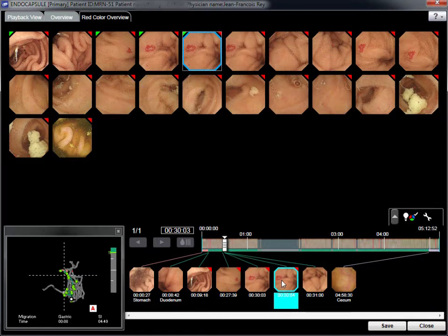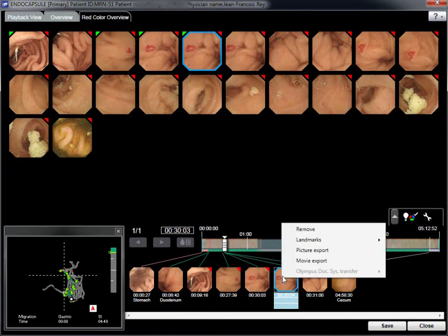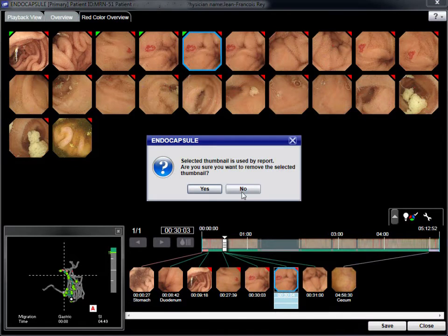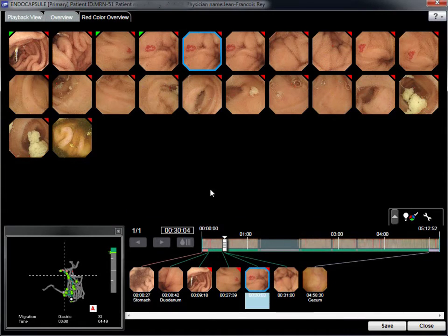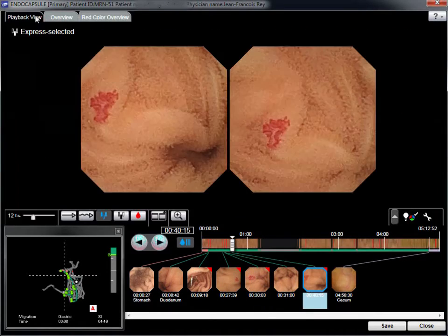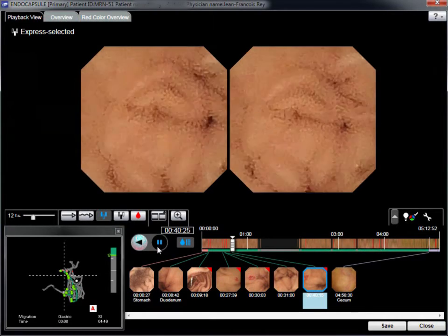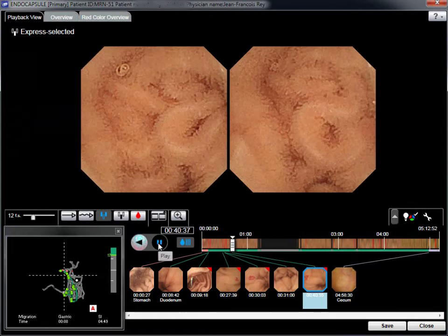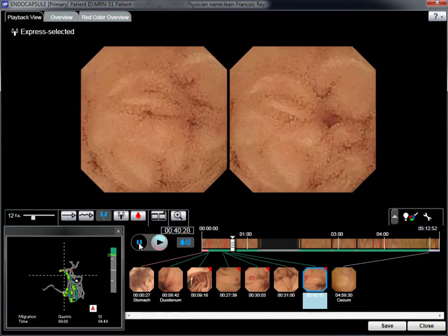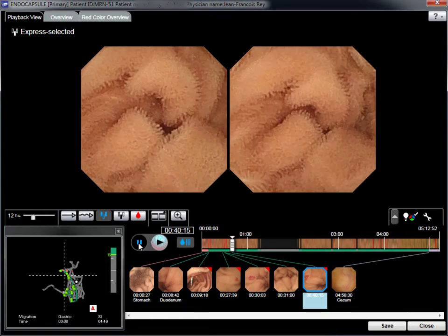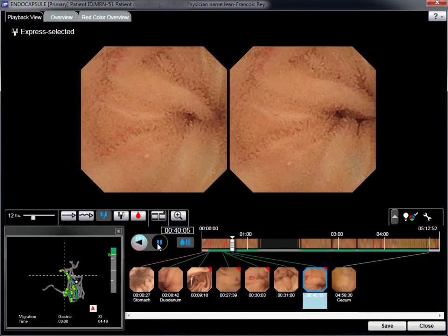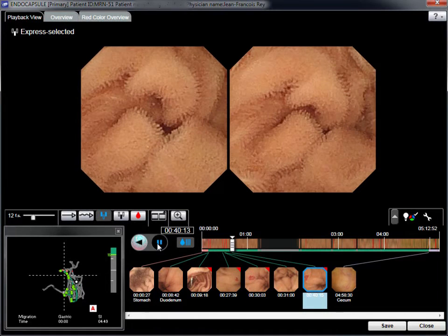If a thumbnail image is not appropriate, it can be removed. The reading functions allow the user to play forward and backward directly on screen, or by scrolling using the computer mouse. The examination time of each abnormality is recorded and the 3D tracking image shows the approximate location in the GI tract.